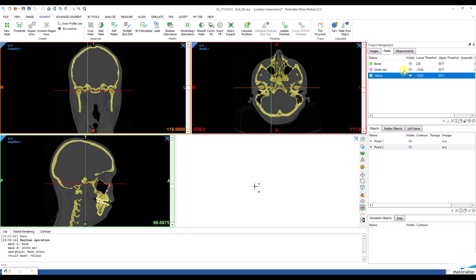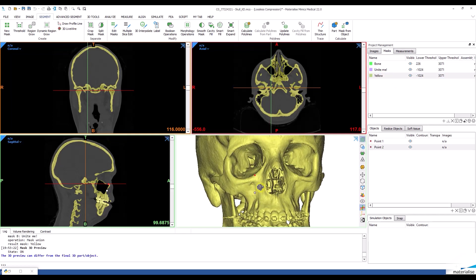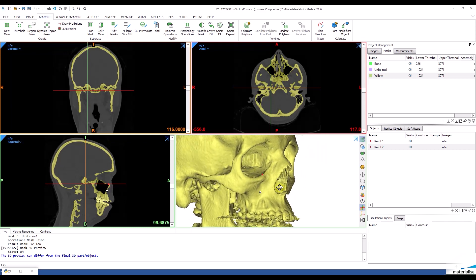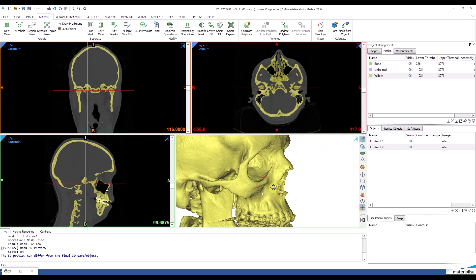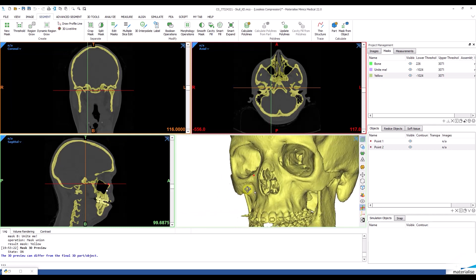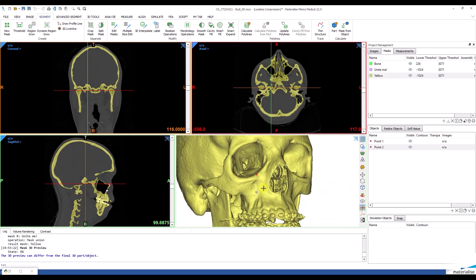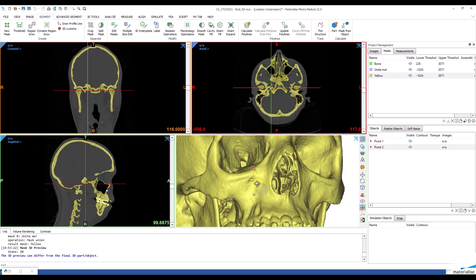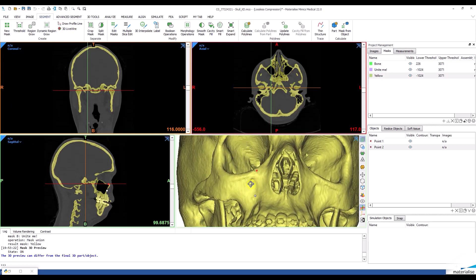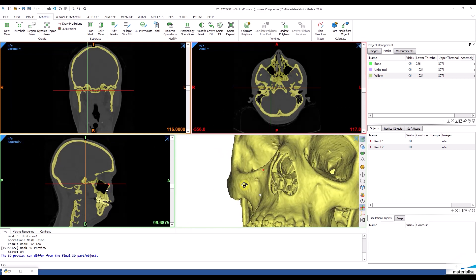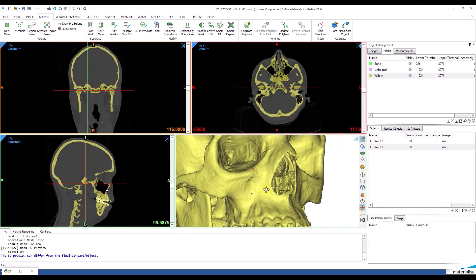And as you can see, all cavities are filled in the orbital floors and also in the cheeks.